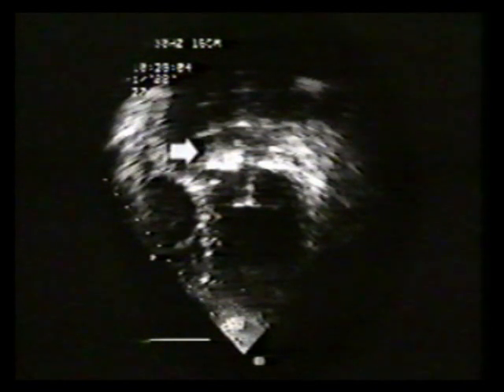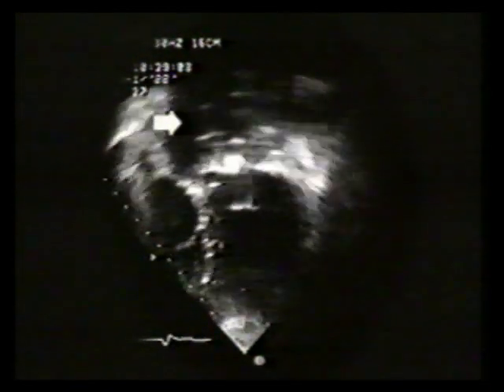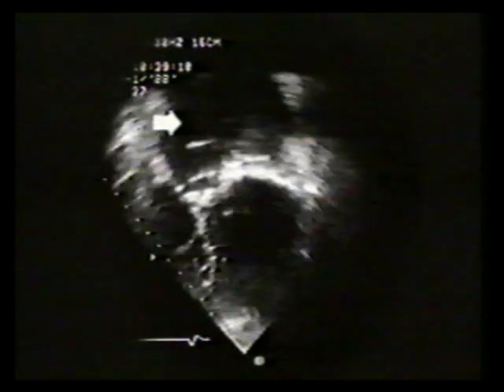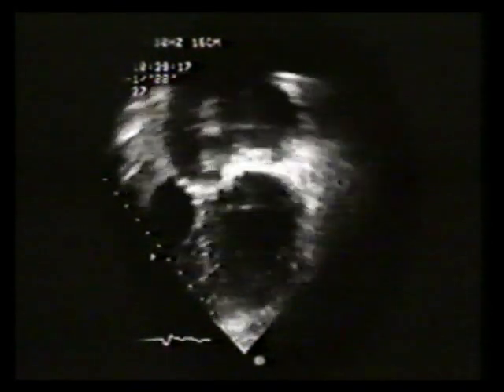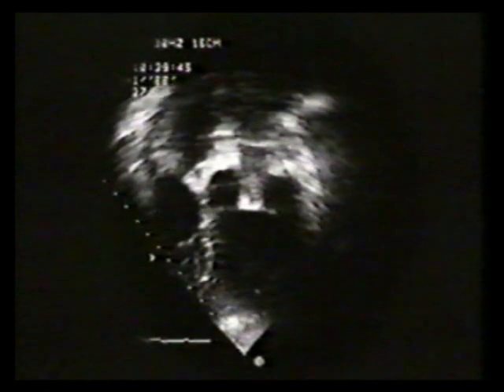Aortic prostheses are typically more difficult to image than mitral prostheses. Poppet motion is identified via the to and fro motion of the mass of reverberations within the aorta. The transducer has been tilted slightly to inspect the aortic sewing ring. There is no evidence of dehiscence.